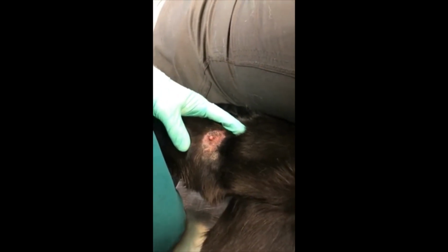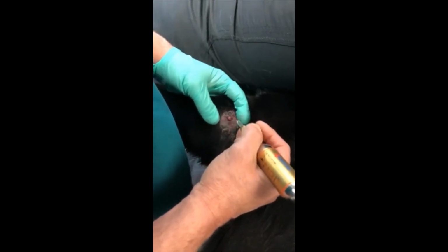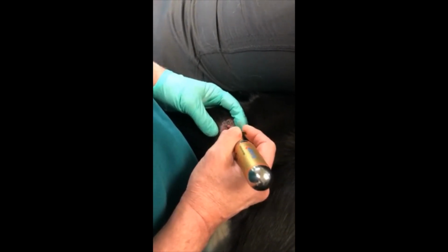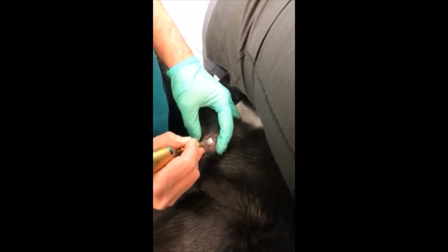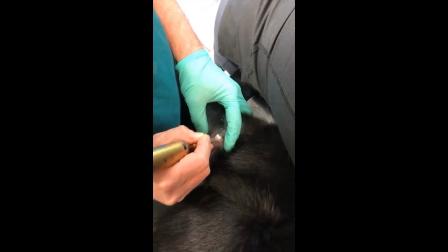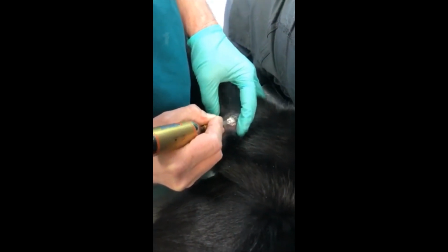We're going to use the D3 tip. We're going to freeze it. Freeze cycle is about 30 seconds because it is not an overly large mass. It's about 3 millimeters in diameter. We're going to go through a thaw cycle and refreeze it again. You'll notice that I'm trying to break away or push away as much of the frost as possible so that we have good contact with gas and tissue, and that we get a very rapid freeze cycle. The rapid freeze cycle yields ice crystals intracellularly, which will rupture the cell wall.